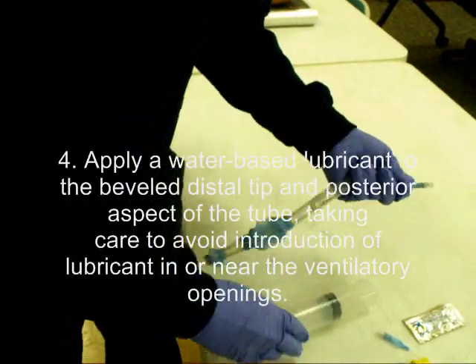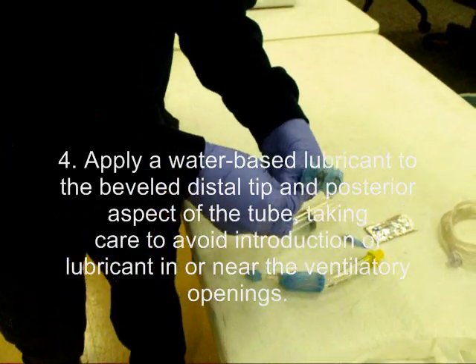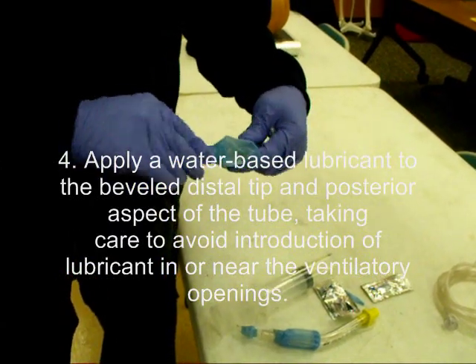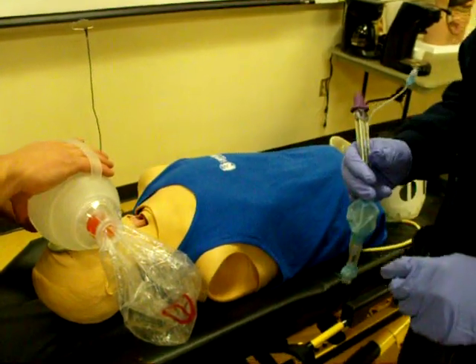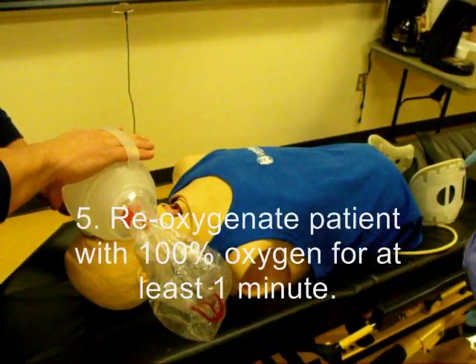Apply a water-based lubricant to the beveled distal tip and posterior aspect of the tube, taking care to avoid introduction of lubricants in or near the ventilatory openings. Ensure that you've oxygenated the patient with 100% oxygen for at least 1 minute.